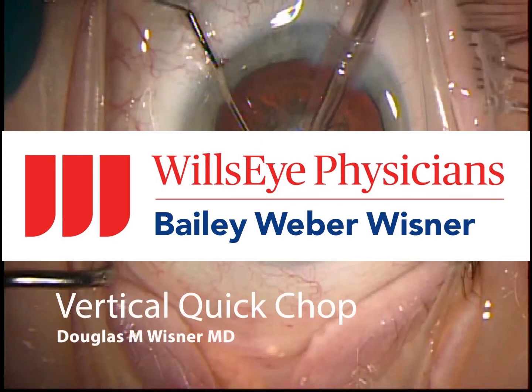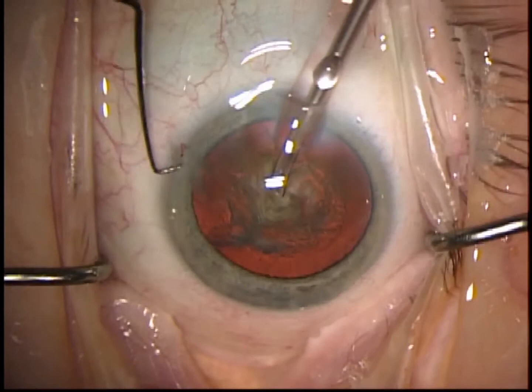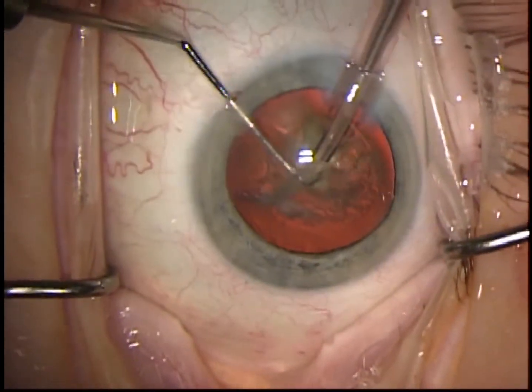Hi, this is Doug Wisner with Will's Eye Physicians. This video demonstrates vertical quick chop technique. I find that it's very useful because you're not near the posterior capsule in most cases, and the chance of posterior capsule rupture is low.